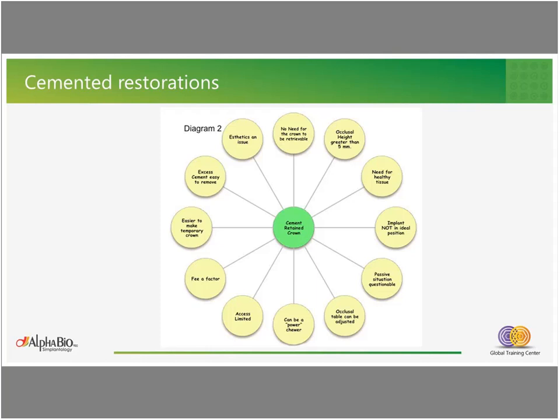It can be managed easily by selecting a good abutment, angulation, and shape. And we have the passivity of fit, and there's a cement that can also absorb some of the overload, and it can also manage sometimes some inaccuracy of the fitting of the restoration to the abutment. So we can see that the cement restoration is relatively much more passive than the screw-retained restorations.